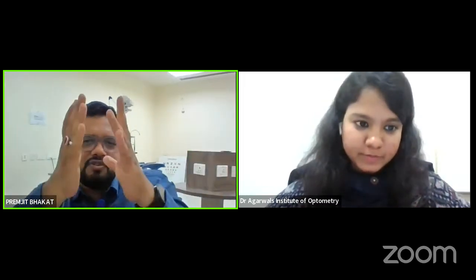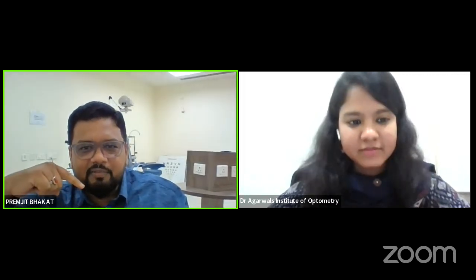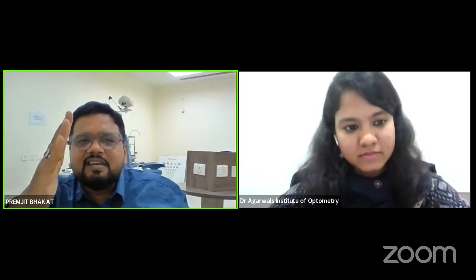When Deepika was presenting, there were many analog scores you use: neutral, worst, bad, good and best. I always say don't use anything negative, otherwise it registers in the patient's mind that something can go wrong. So I usually use, from one of the literature I found, 0 to 10. I said 0 is not very comfortable, 10 is very comfortable, and 7 is something you want. I always teach students that way.